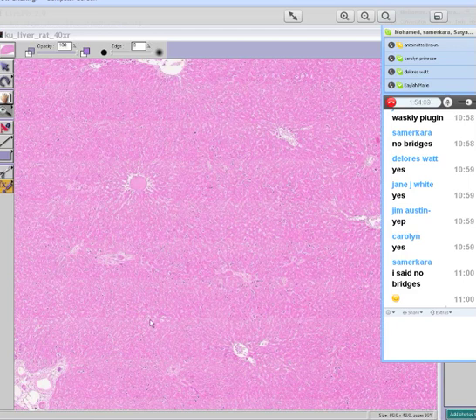Because in hepatitis, you'll see inflammatory cells in that portal area. And maybe they'll even extend into the sinusoids and central vein areas as well. In cirrhosis, you'll see that that connective tissue connects with adjacent portal areas, and that's what's forming the nodules.